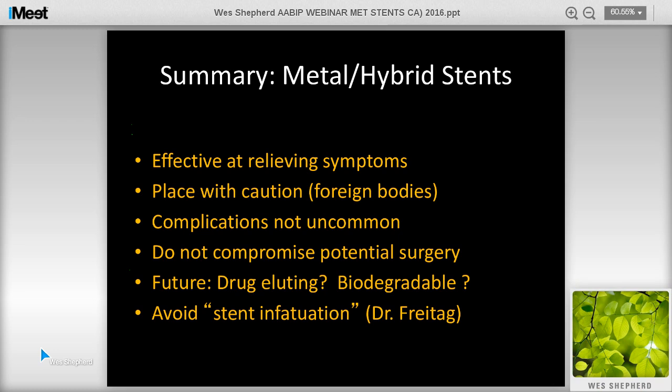And if there's any other last questions from the audience, otherwise I'm going to ask Dr. Shepard one last question, which would be for patients who have metallic stents placed for malignant disease, what sort of pulmonary toilet mechanisms or methodologies do you use to assist them, or do you find that the covered metal stents don't require any additional inhaled mucolytics or hypertonic saline, that sort of thing?